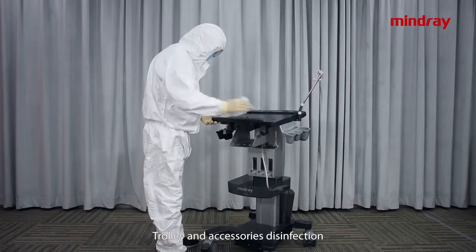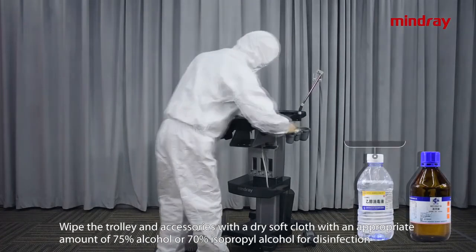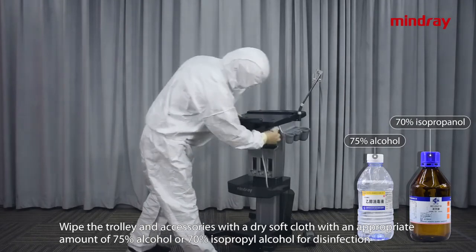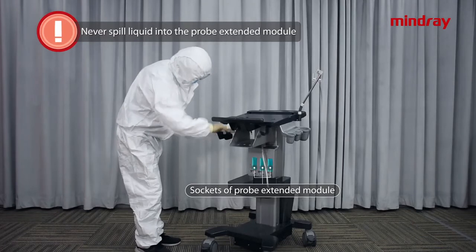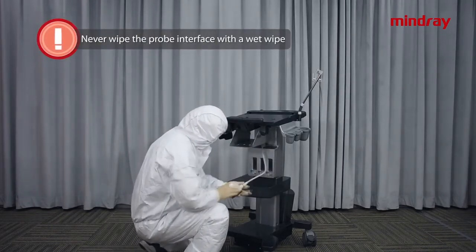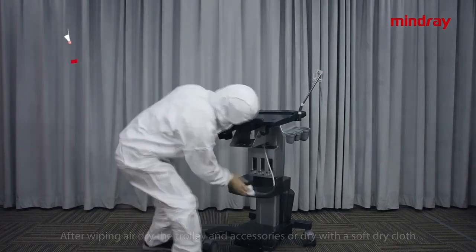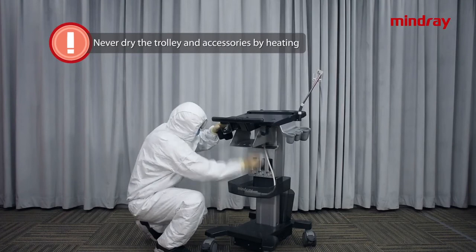Trolley and accessories disinfection. Wipe the trolley and accessories with a soft dry cloth with an appropriate amount of 75% alcohol or 70% isopropyl alcohol for disinfection. Caution: never spill liquid into the probe extended module. Never wipe the probe interface with a wet wipe. After wiping, air dry the trolley and the accessories or dry with a soft dry cloth. Never dry the trolley and accessories by heating.